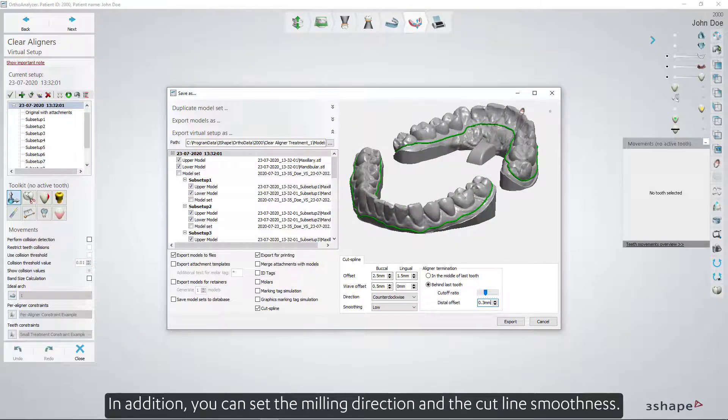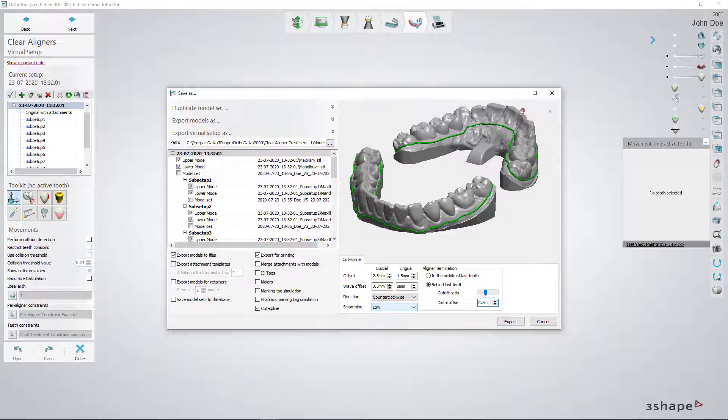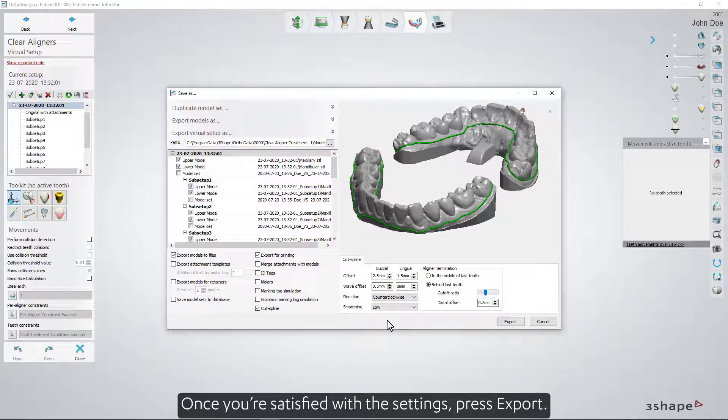In addition, you can set the milling direction and the cut line smoothness. Once you're satisfied with the settings, press Export.